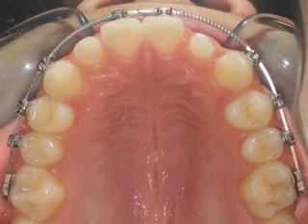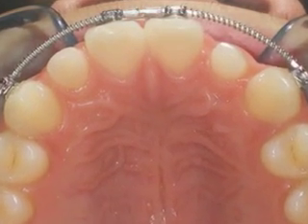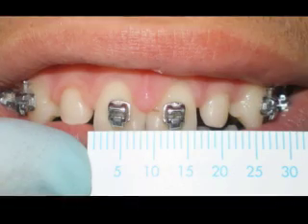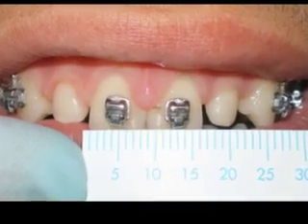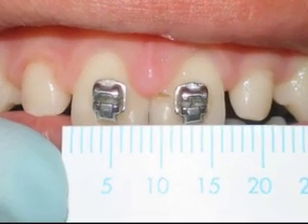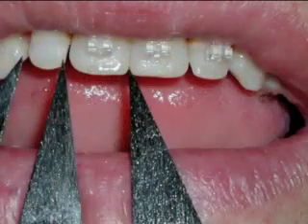Here's an occlusal view of the two teeth we're going to be working with. Note the nice spacing both mesial and distal to the target teeth. Now, we'd like to determine the ideal size of the teeth that we're veneering. If you remember from your old oral anatomy days, the upper laterals are about 0.7 or three-quarters the size of the centrals.